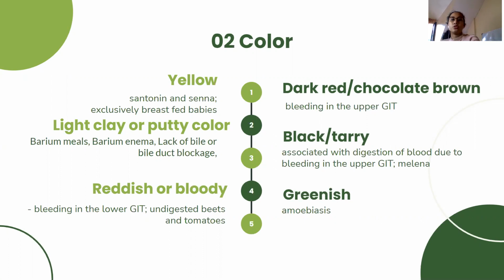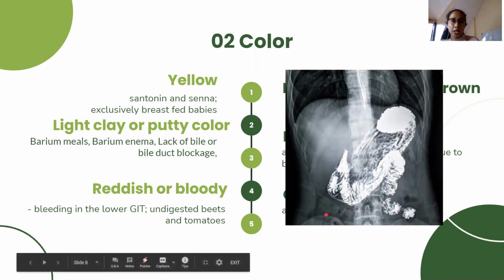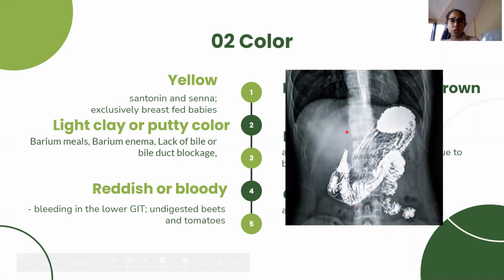So class, here is a photo for barium enema, barium meals. They give barium meals to patients, and after an x-ray, the part of the digestive system that they want to check is more visible.